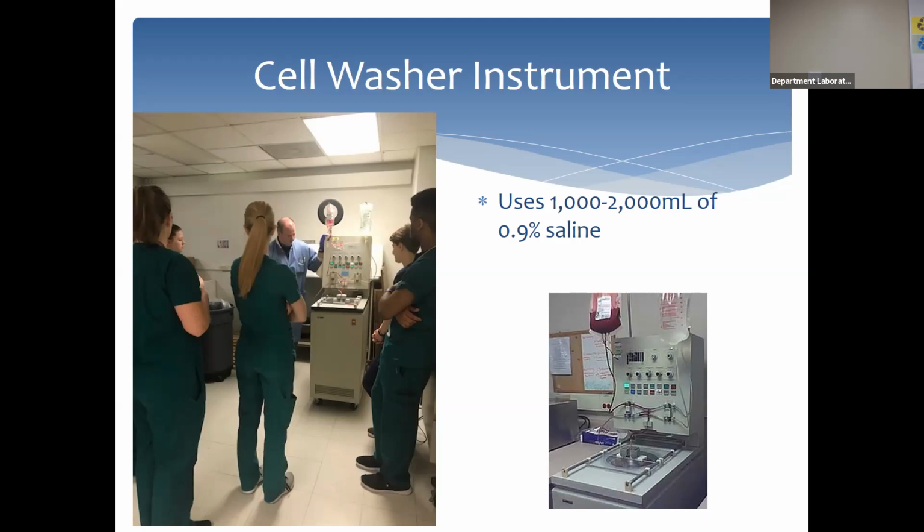And then blood is pulled out of your donor unit into this middle part here, and this middle part centrifuges, all right, so it spins, and here's your sensor right here, so it can sense when the red cells have stopped flowing into your donut bag in the middle, all right. So once your cells are in there, it's going to centrifuge it, then it's going to add saline, and it's going to do a series of washes. It'll agitate it for a little while, and then it'll centrifuge it, and then it will aspirate all of that saline out.